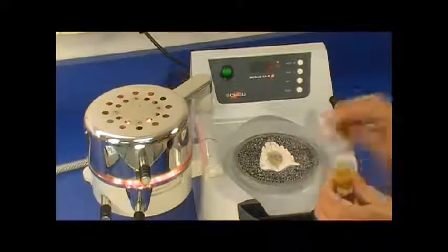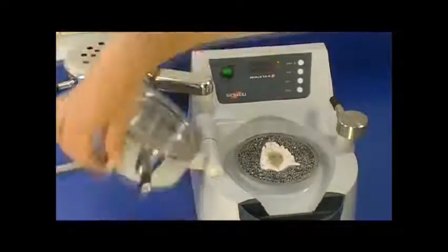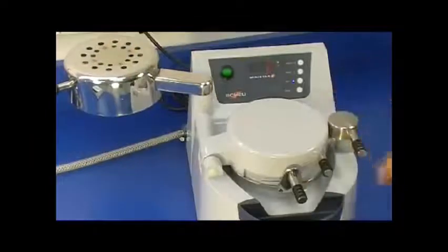Once heating cycle is ended, swing lamp to back of machine. Rotate chamber over pellet cup and lock chamber in place to start forming, cooling, and acrylic curing process. Once forming and cooling process has ended, release air pressure.